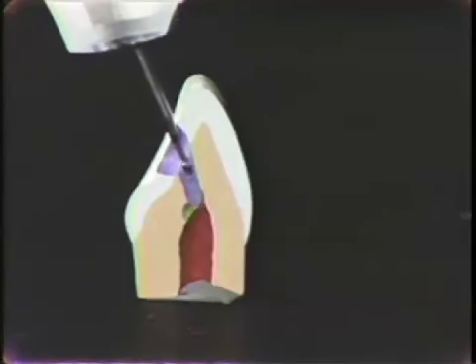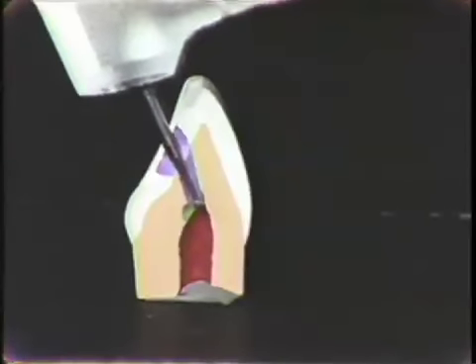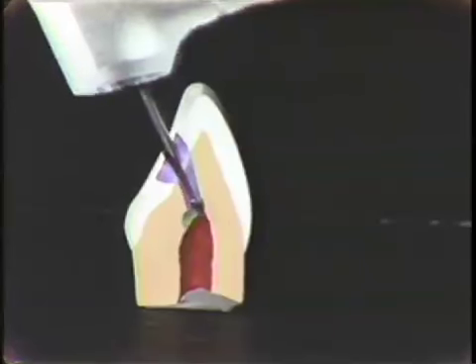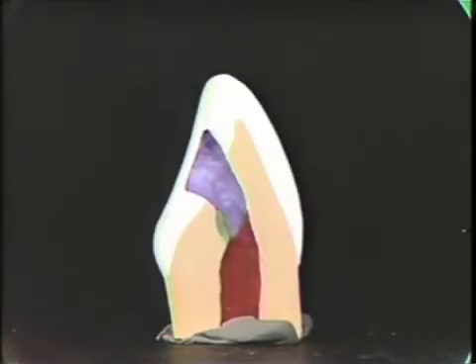Now, you keep on doing this, in and out, feeling for the roof, making sure that you keep away from the walls so you don't gouge the tooth, until you feel the burr pass from the pulp chamber to the surface without any kind of bump or click. When you feel this, you turn the handpiece off, you get your Endodontic Explorer, and feel the walls of your cavity preparation. Make sure that you've completely removed the roof of the pulp chamber and that you haven't gouged the walls. We've completely removed the roof.